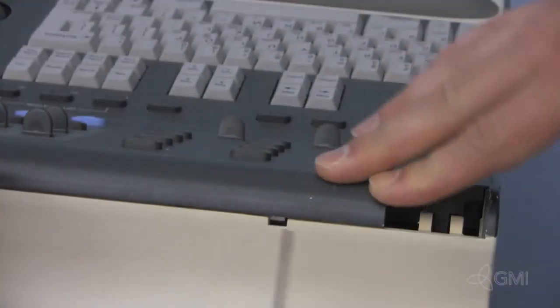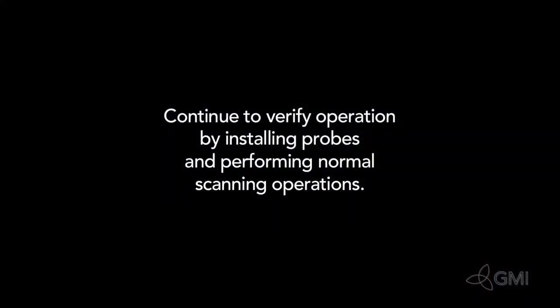Reinstall and slide the UILock back in place. Verify operations by installing probes and performing normal scanning operations.